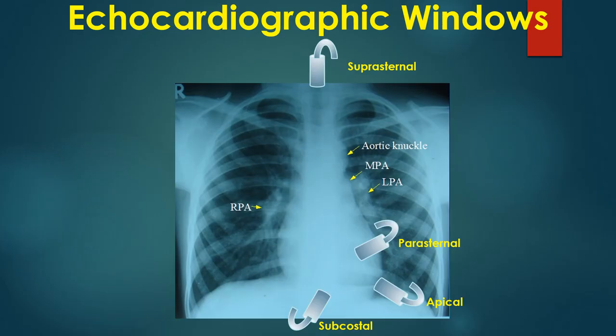The 4 common locations at which the echocardiographic transducer is placed for imaging are the parasternal, apical, subcostal and suprasternal. Parasternal views are often obtained first, followed by apical, subcostal and suprasternal. A good knowledge of the anatomy of the heart is needed for interpretation of images from each view. This becomes more difficult in complex congenital heart diseases where cardiac chamber positions and size may vary.